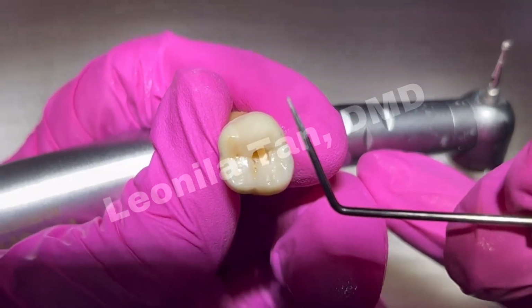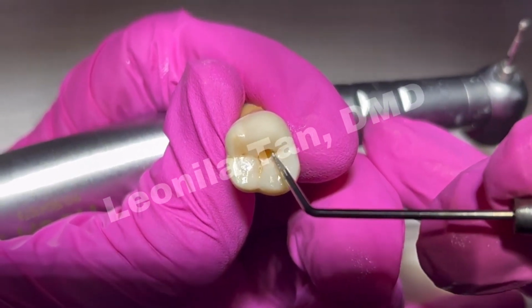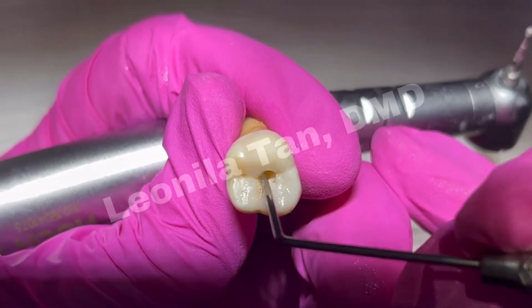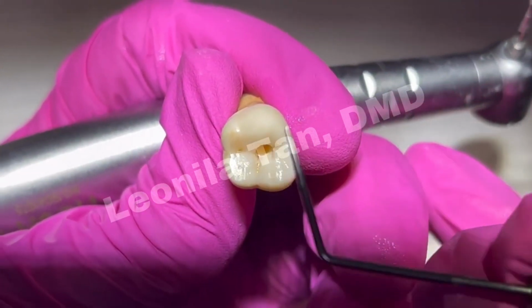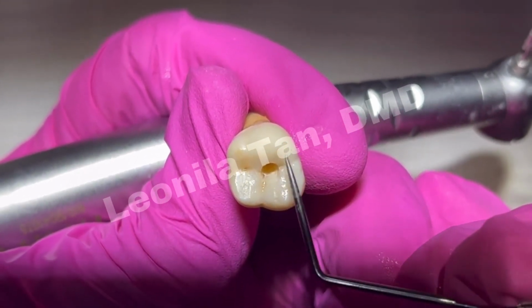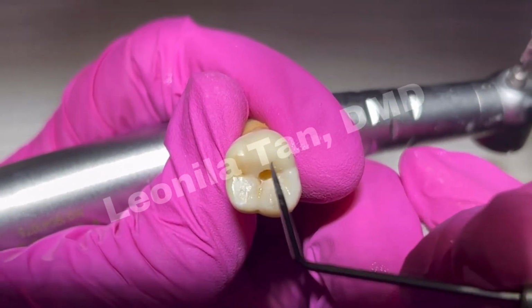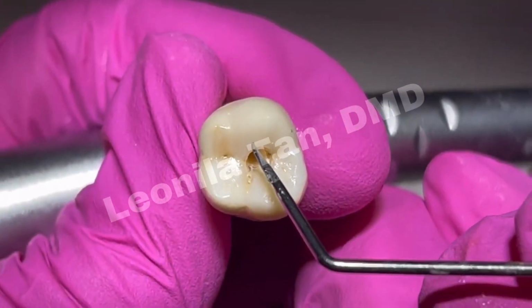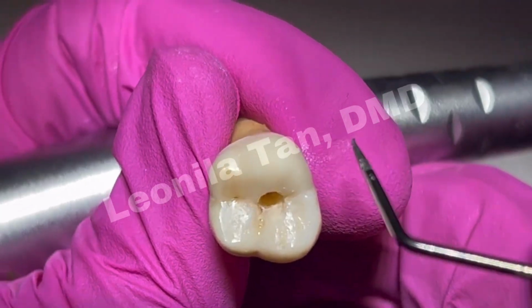Another thing to take note of in doing access for molars: you initially start at the middle of your central groove, directing it palatally, but as you go to the second or third molar, your access prep moves a little bit towards the middle. In your drawings, remember that your access forms were exactly on the mesial side. That's your first molar, but we're dealing here with a second molar.